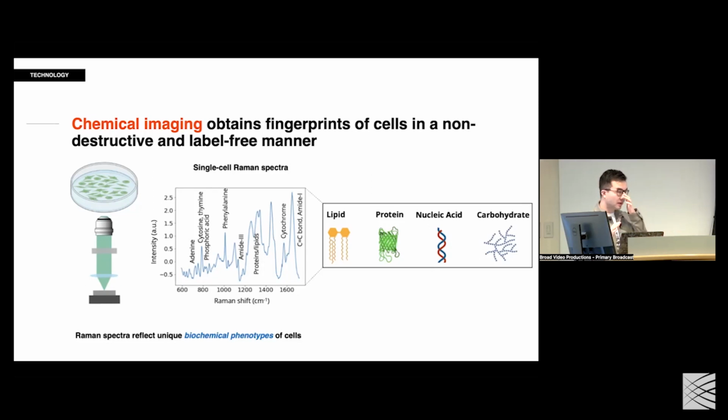So if you're asking me which protein is actually this, we don't know. But there are computational ways to deconvolute all this information too. But for this, we're doing a composite measurement of different kinds of molecules inside of a cell. So this will give us a fingerprint or a profile of a cell in a non-destructive and label-free manner. Just put the cell there, take a picture. They will give you 1,000 dimensions per pixel.